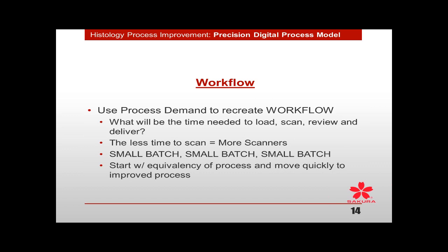Again, small batch, small batch, small batch. Even if you can load 300 slides into a scanner, you're going to be working with the digital images in much smaller batches as they come out. You can't wait till those 300 slides complete and then decide that you need to do rescans. You're continually working with them. So again, you've got people that were dedicated to other production who are now dedicated to the digital process.